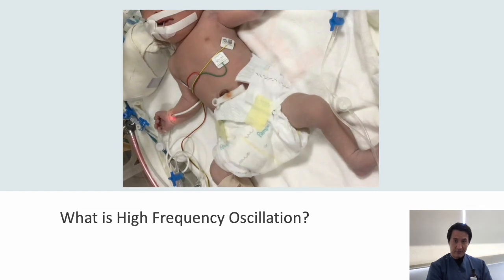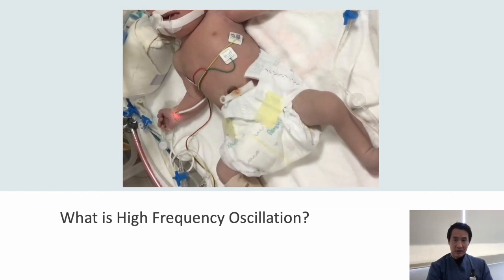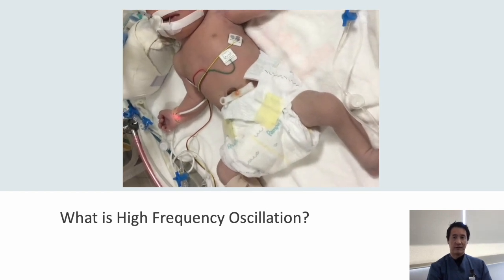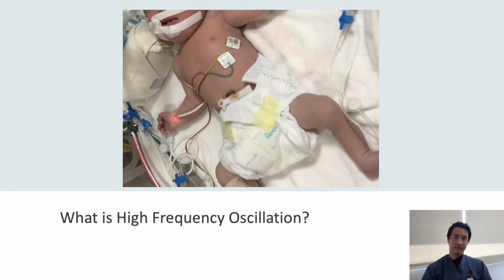Now, everybody, what type of ventilation mode do you think HFO is? You may feel that it's a slightly special mode of gas exchange, different from a conventional ventilator, which can exchange gases by oscillating.